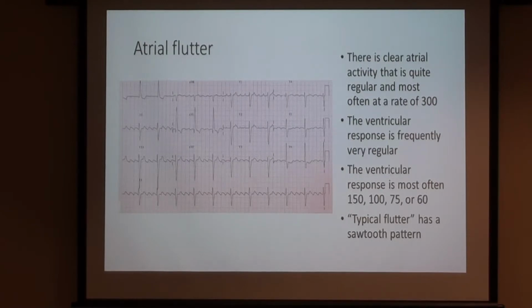Most people are already feeling their SVT, so they actually feel pretty nice about it, most of the time. It can make you a little shorter of breath, it can give you a little pain in your chest, but it goes away so quickly that it is incredibly safe. I actually think it's best to record a 12 lead while you're doing it because you'll get all the information laid out for you, right? So run the 12 lead EKG, slam it home, and then you'll be able to tell very often, and sometimes fix the problem.